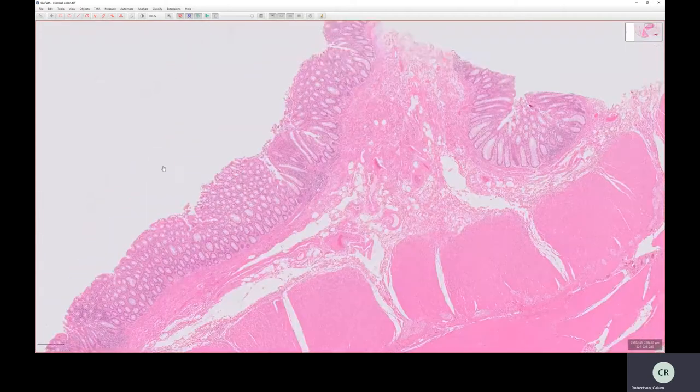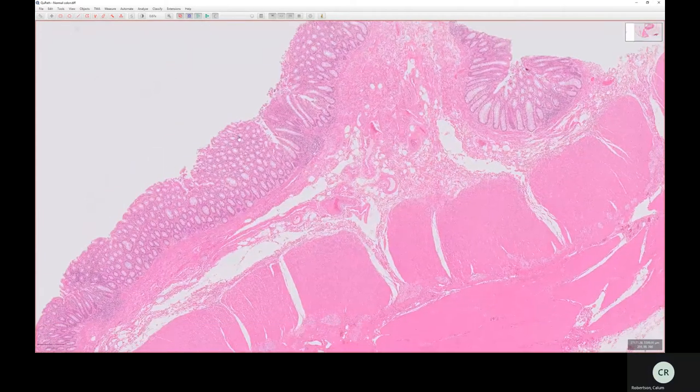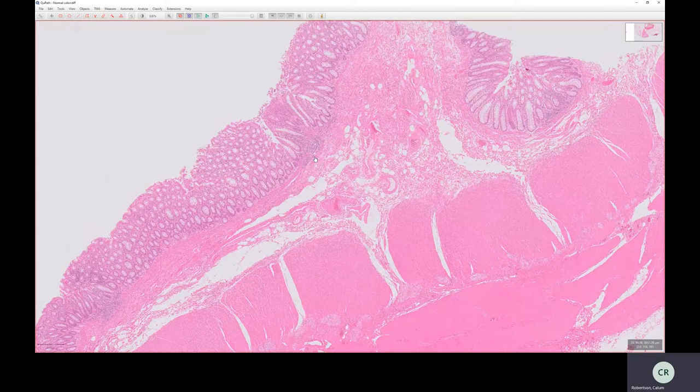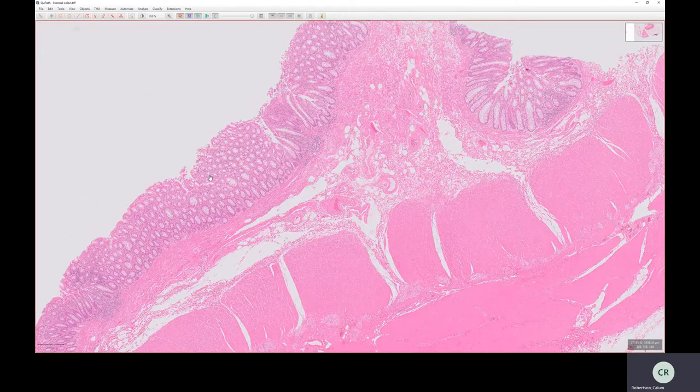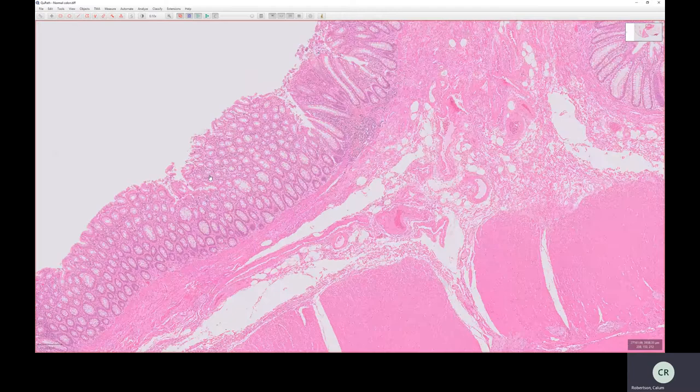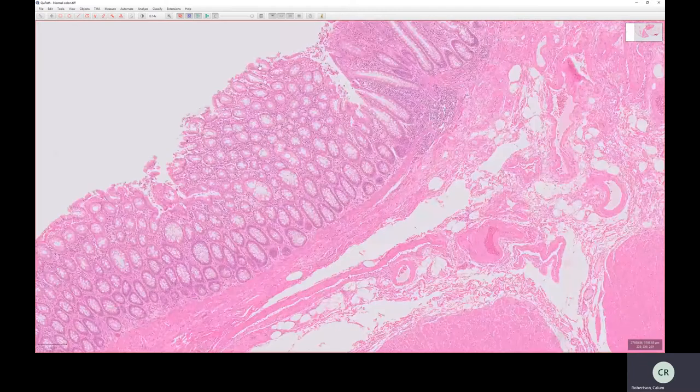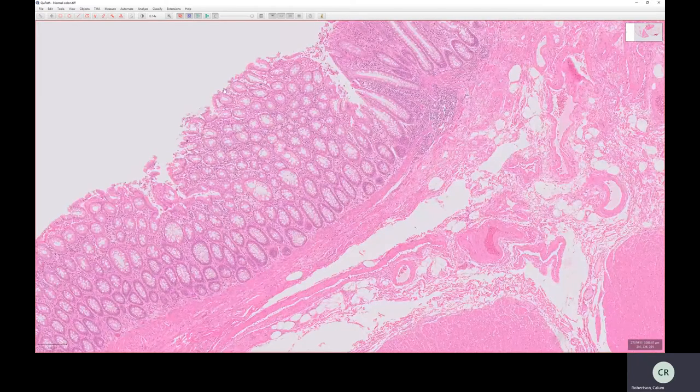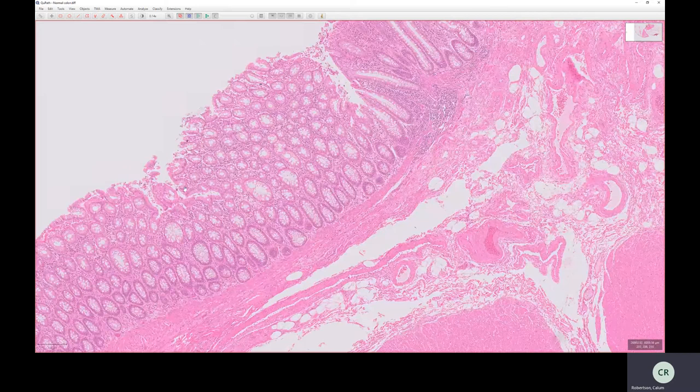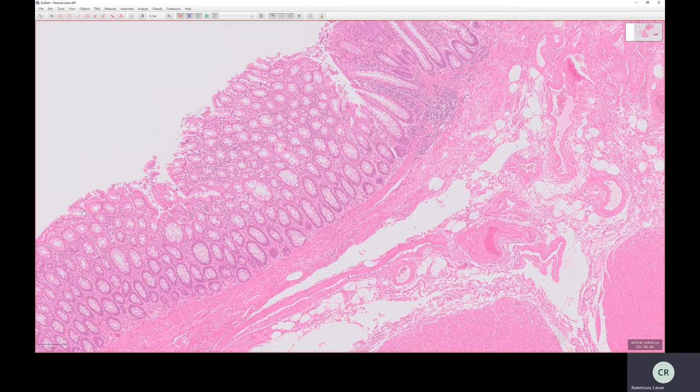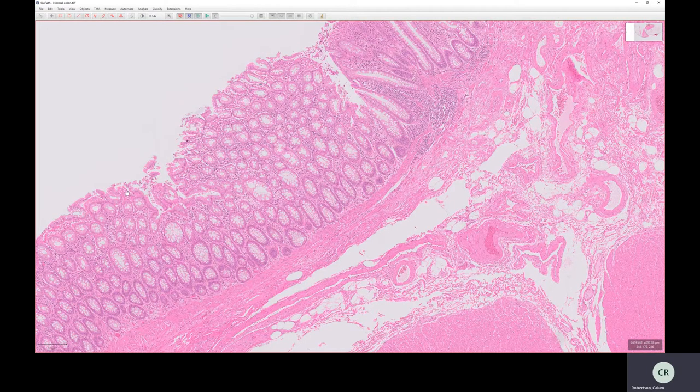So the first layer is this one here, the one of the luminal aspect. That's called the mucosa. The mucosa is made of three main sub parts. So at the very luminal aspect, we've got a layer of epithelium. Now we're in the colon, so this is simple columnar epithelium here. And this is the epithelial lining, which is the most superficial part of the mucosa.